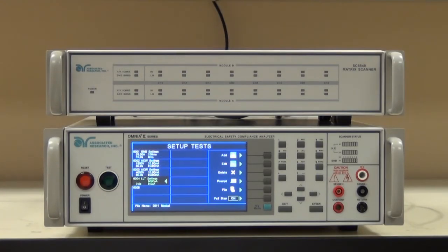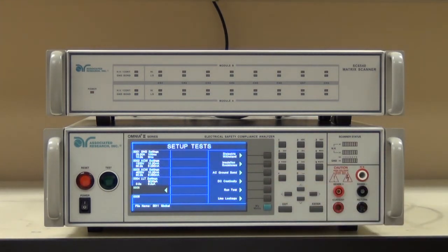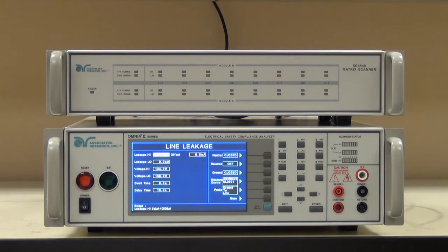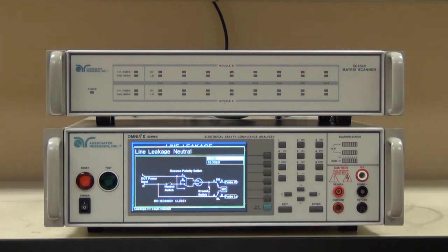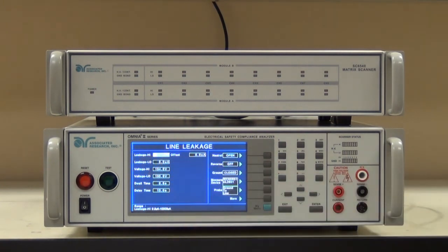We just set up the earth leakage test with normal conditions. Now we need to add some fault conditions. For the purposes of this demonstration, I'm not going to add all eight combinations for eight earth leakage tests — we'll do a few, and these could be added later. So now that we're doing single fault conditions, we need to choose a fault. In this case, I'm going to choose an open neutral. When I do that, the relay internally on the neutral switch is going to open up. The one other thing I need to change is my leakage high limit.